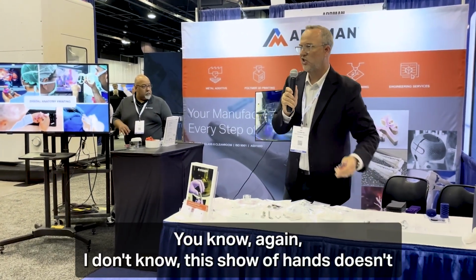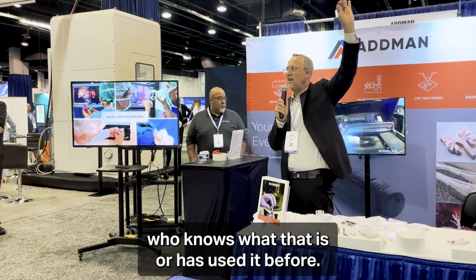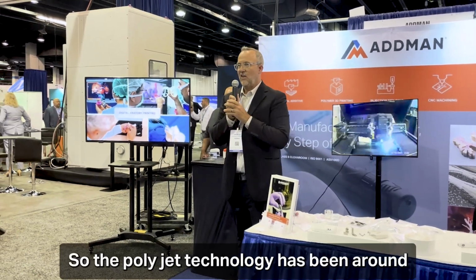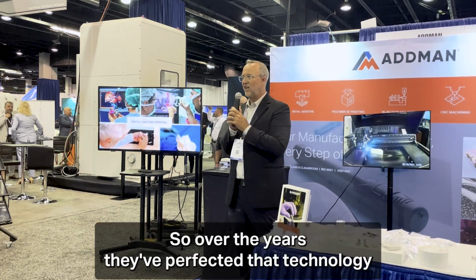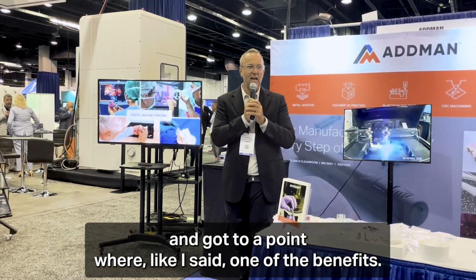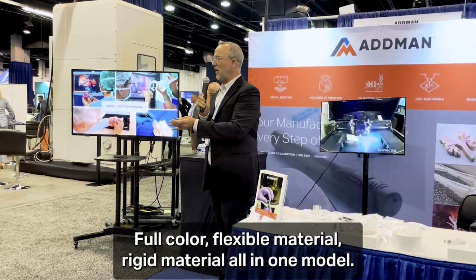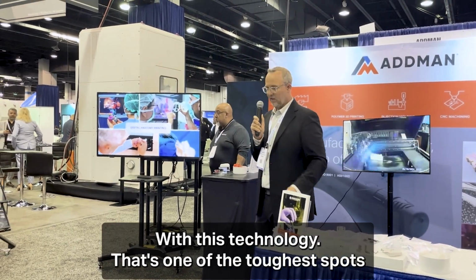Again, I don't know, a show of hands of who knows what that is or has used it before. Does everybody know what digital anatomy printing is? Maybe sort of. So the PolyJet technology has been around for 25 years-ish, somewhere in that range. So over the years, they've perfected that technology and got to a point where, like I said, one of the benefits, full color, flexible material, rigid material, all in one model. So you can do really complicated models of the human anatomy with this technology.